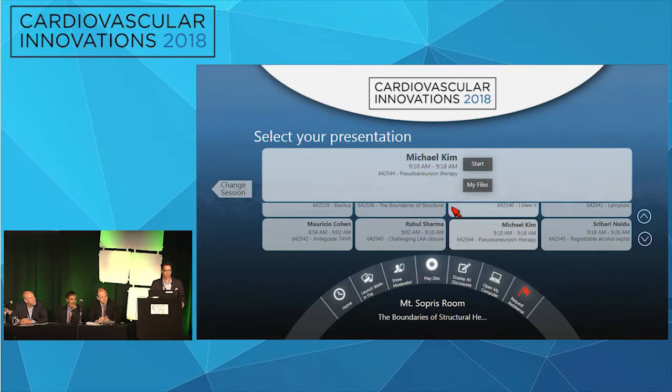Right. So if there's even a trickle, one red blood cell that's able to go through, that PSA will remain patent. Right, just from the high pressure in the cavity. You had complete closure right away, which is what I think led to the success of what you did. Very good. That's good.